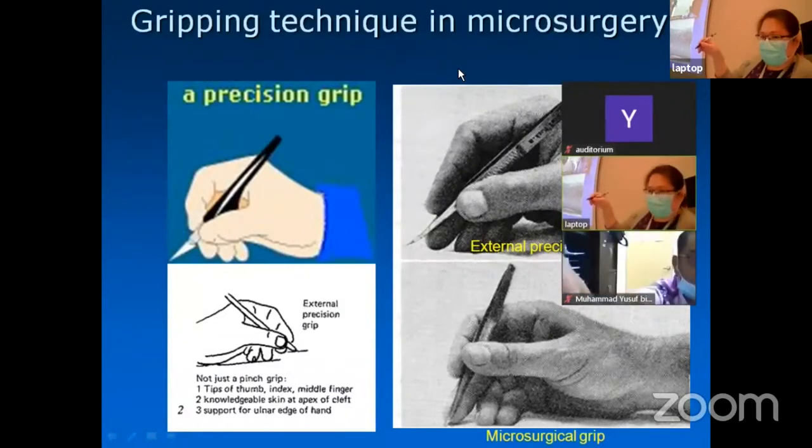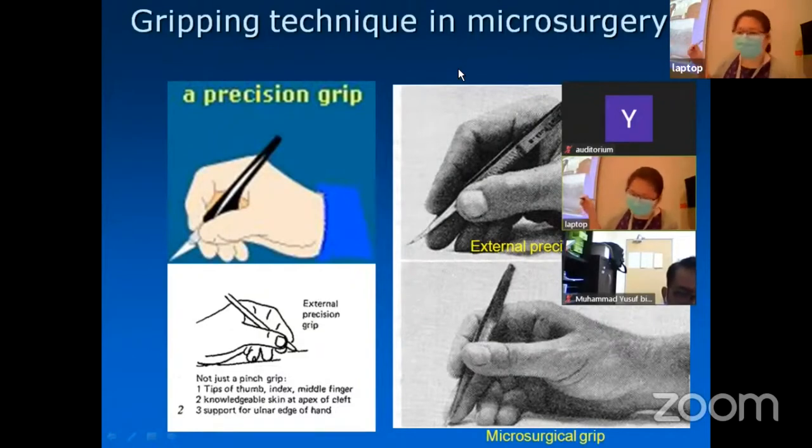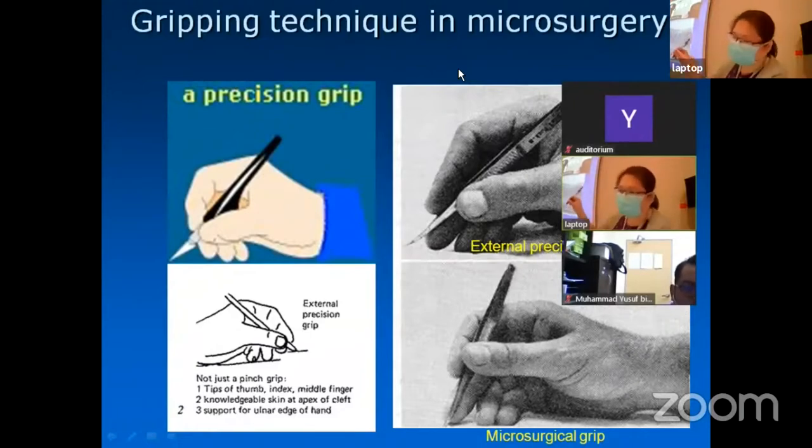Okay, I believe everyone knows how to hold a pencil or a pen, right? In ophthalmology, because we are doing microsurgeries, the grip that is involved is precision grip, which normally we use external precision grip. External versus internal, what's the difference? In the external precision grip, the body of the instrument or whatever you're holding will be outside the eye.